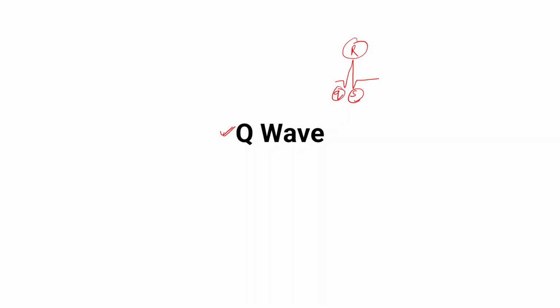Sometimes in some leads you will find something like this. You can see there is no Q wave because the first wave is a positive wave, so this is the R wave, and the second wave is a negative wave following the R wave, so this is the S wave.